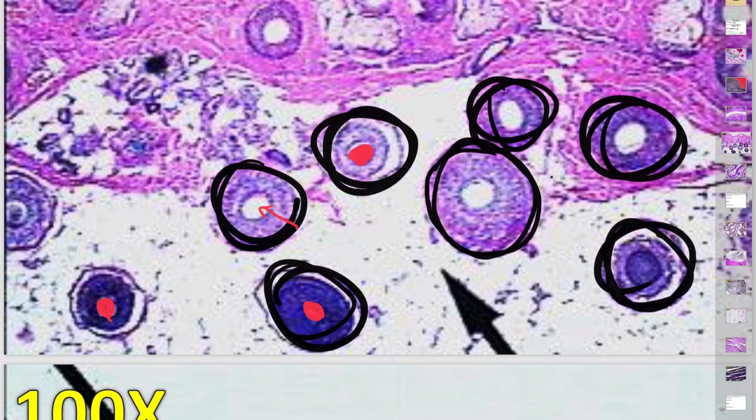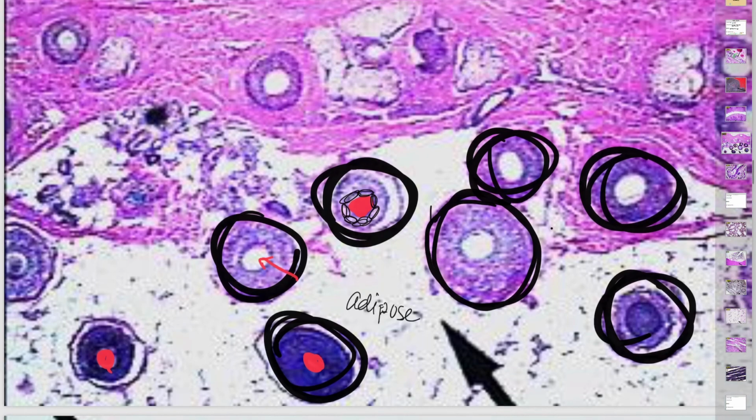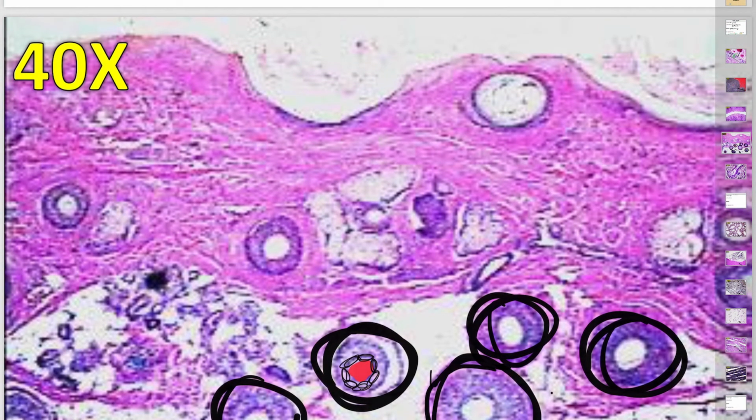So we have blood there, but we also have that simple columnar or simple squamous epithelium that we talked about. I'm going to make this a little bit smaller, make a different color. So right there'd be a single layer of cells that allow for the blood to move in and out there. You also have in here some adipose, some fat, but we'll talk more about that when we get to connective tissues. There's even up here, you'll see, right up here, there is some muscle.